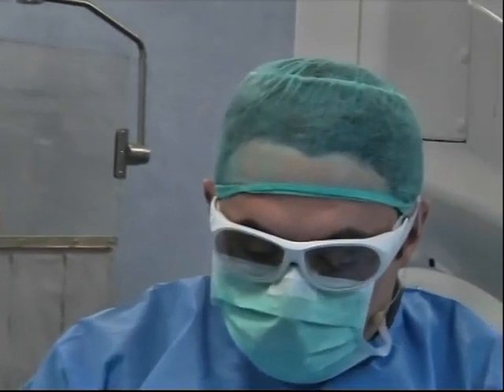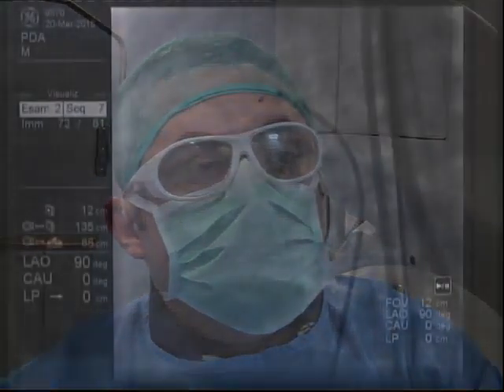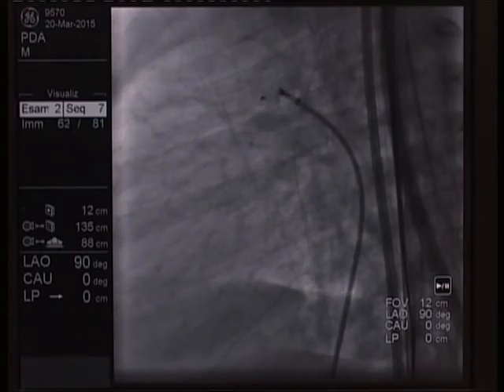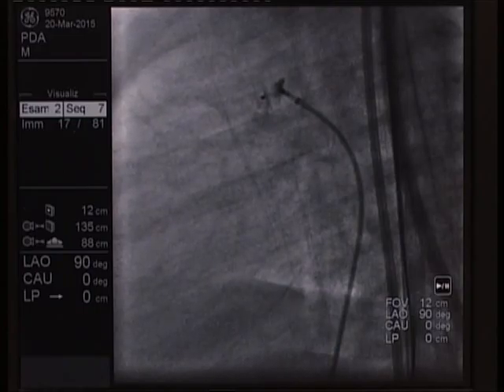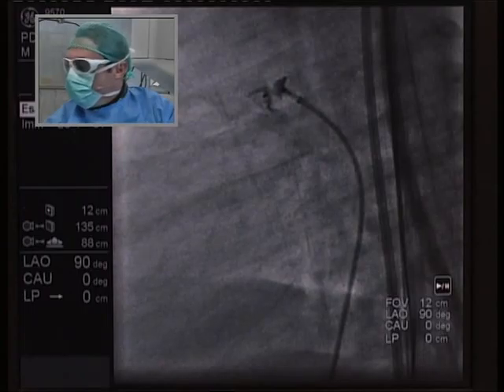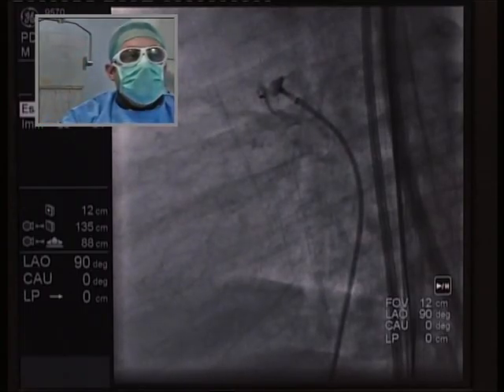Was there catheter manipulation, a right-sided hemodynamic study, before you took the angiogram, that could have potentially caused spasm, so that by the time you did your angiogram, that wasn't the original configuration of the PDA? They're trying to justify a patient that has failure to thrive with just a duct that's 2.5 millimeters. So that was the question: could there have been spasm?